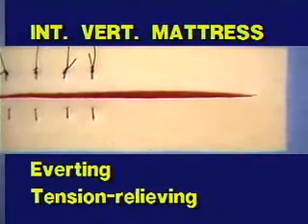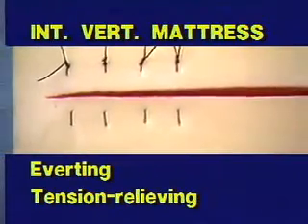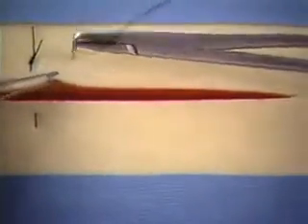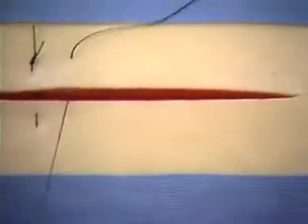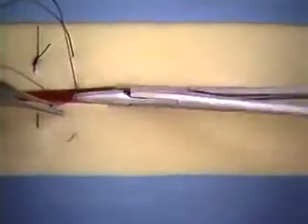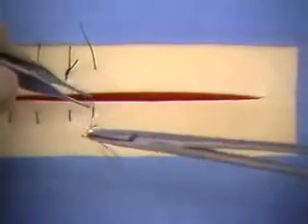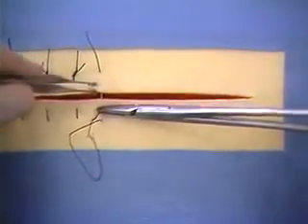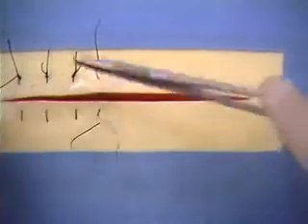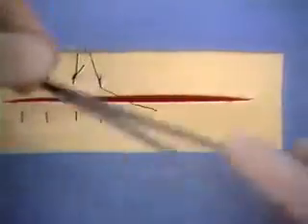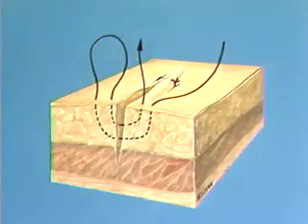The eighth pattern to be demonstrated is the Interrupted Vertical Mattress Suture. This is an everting and tension relieving suture pattern. The vertical mattress suture is introduced eight to ten millimeters from the incision on one side, passed across the incision line, and made to exit an equal distance on the opposite side. The needle is then reversed and returned perpendicular to the incision line to the opposite side by passing four millimeters from the incision on both sides. The knot is tied on the side of origin.